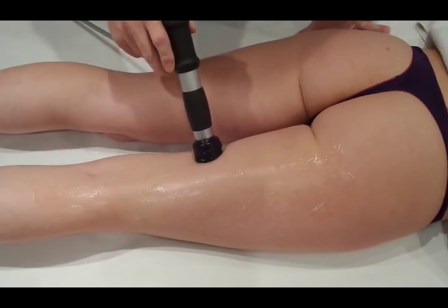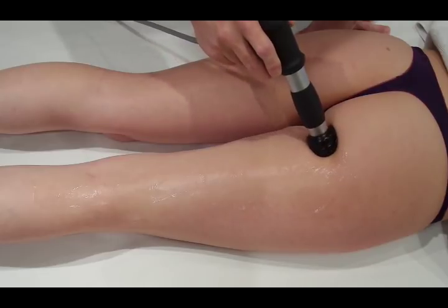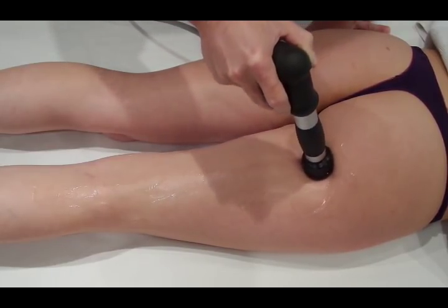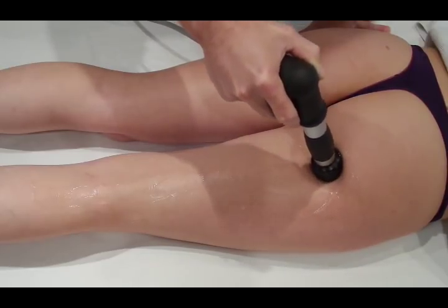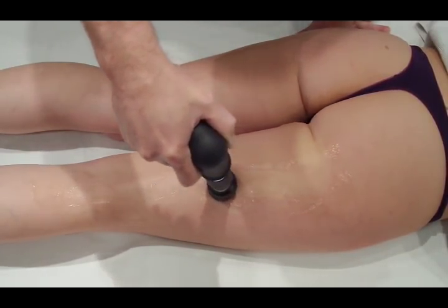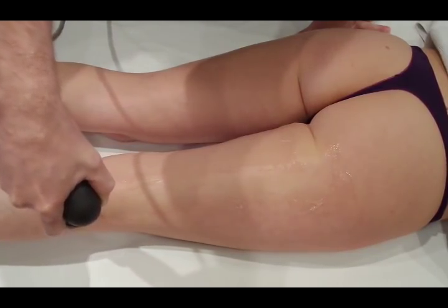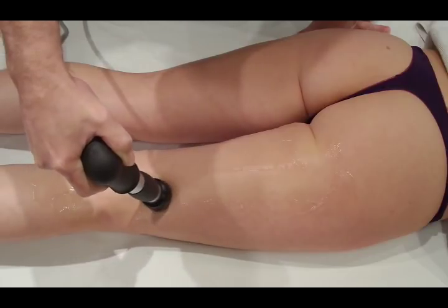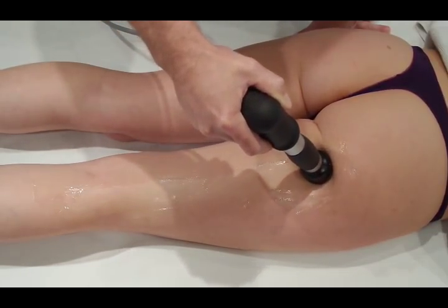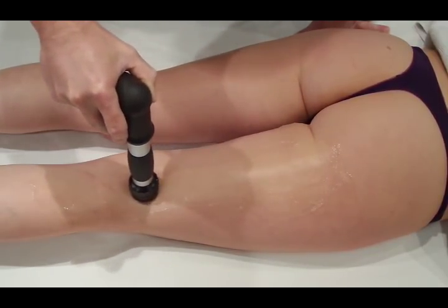Some people use a snaking pattern. You really want to snake up and down the muscles in relation to the line of the fibers. There have been some studies that show you can break the bonds between the myofilaments, but only if you're going at a parallel angle to the myofilaments. So in this case we're going straight up and down — if you were going across, you wouldn't really be doing that. So we're moving up and down until we get to the 3000 shocks.